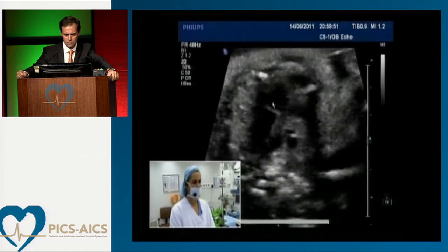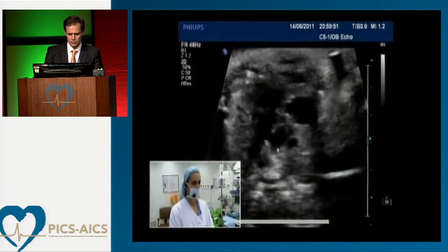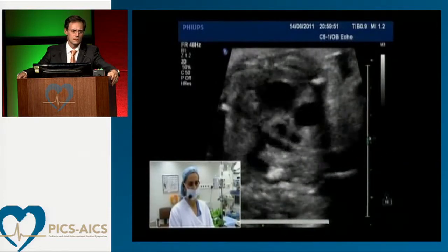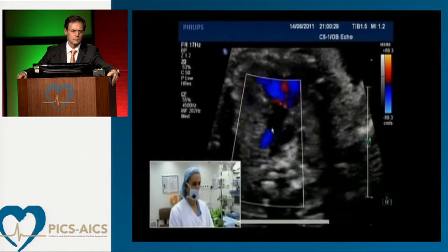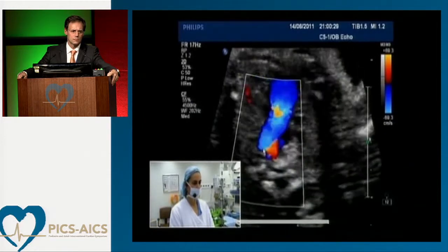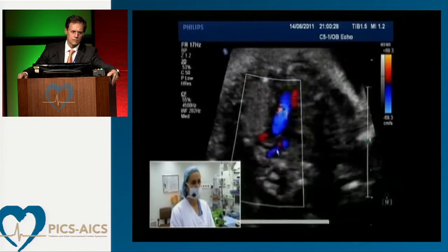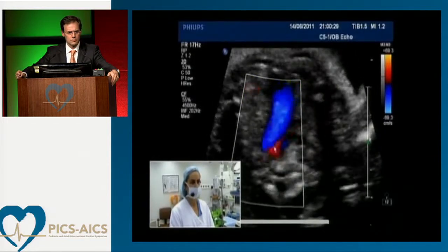And here we are assessing the pulmonary valve and pulmonary artery, and here we can see the ascending aorta, which has a very good size, so there is no aortic hypoplasia. And here, the flow across this is the ductus, so this is RV and this is ductus, and here you can see the descending aorta, and the flow is retrograde at the transverse aortic arch. So this is one of the criteria to indicate the procedure.